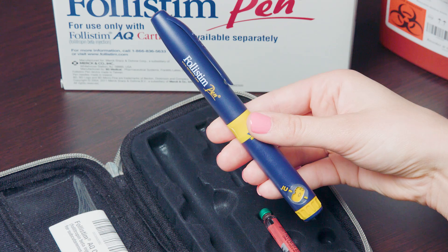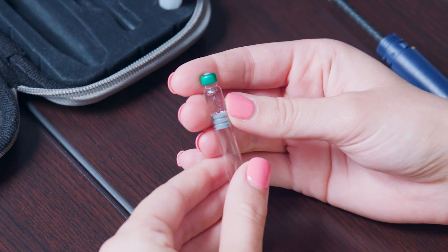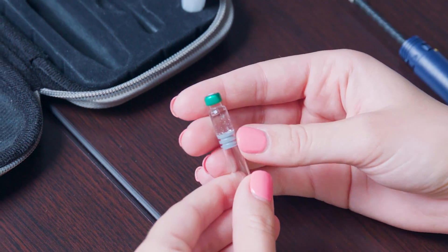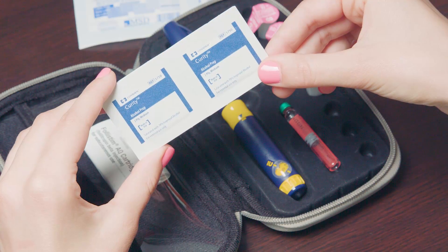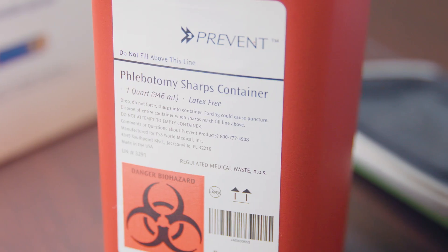First, you will need the following: a Follistim pen, a Follistim AQ cartridge, a BD Micro Fine Pen needle that comes with the cartridge, alcohol swabs, sterile gauze, and a sharps container.